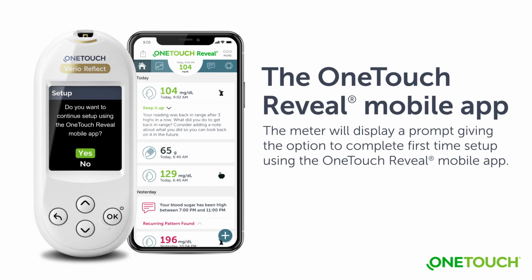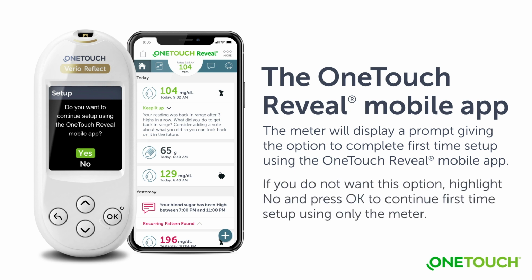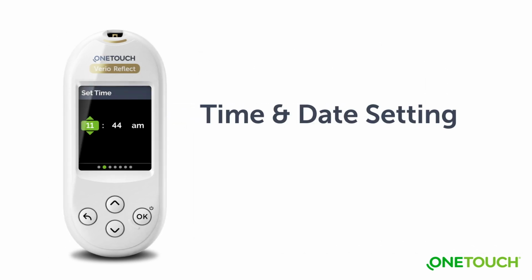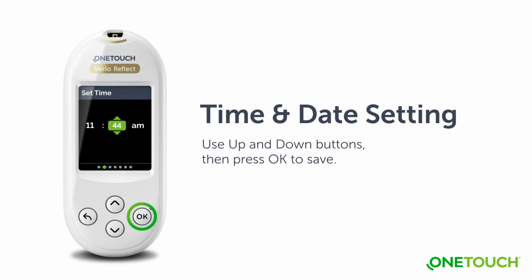Your OneTouch Verio Reflect meter is designed to connect with the OneTouch Reveal mobile app. The meter will display a prompt giving you the option to complete first-time setup using the OneTouch Reveal app. If you do not want this option, highlight No and press OK to continue first-time setup using only the meter. To proceed with setup, your meter displays time and date set screens. Using the up and down buttons, confirm or edit the preset data. Then press OK to save. Time and date format cannot be changed.